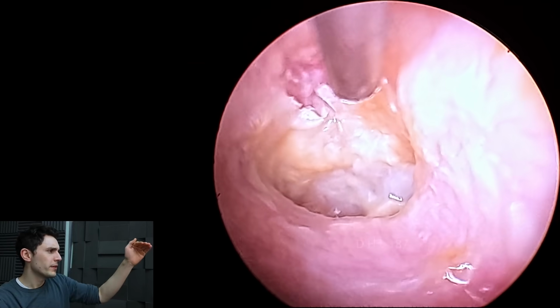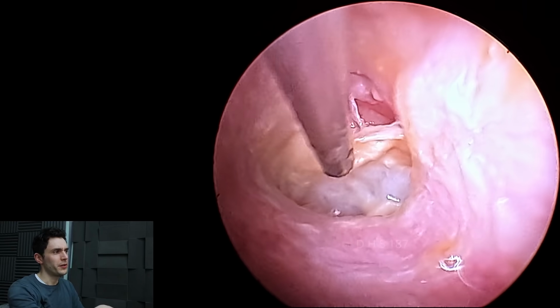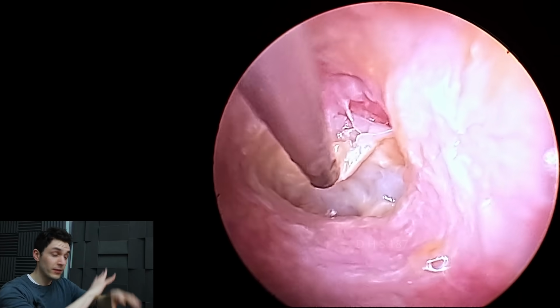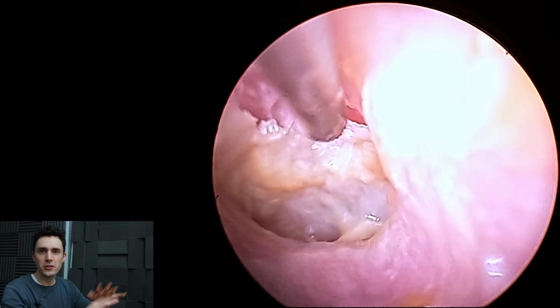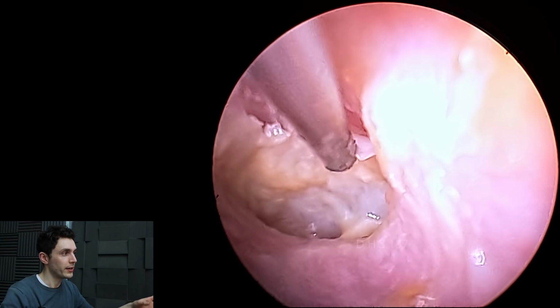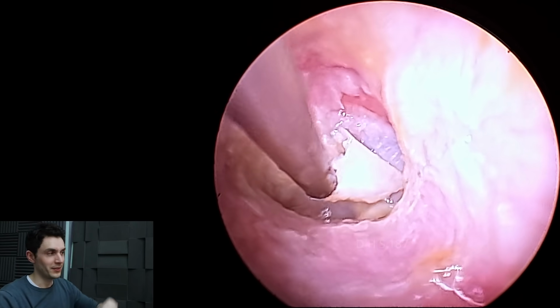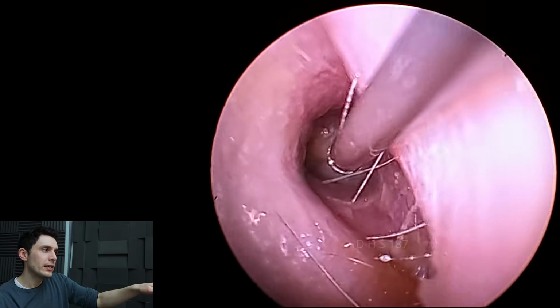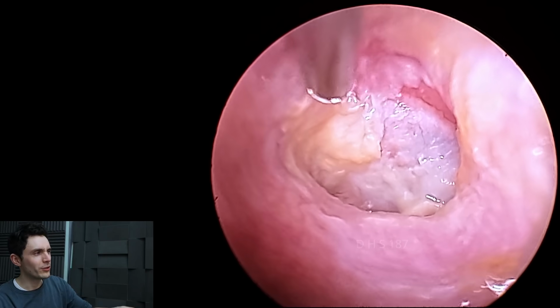So we're peeling off this neotympanum here, and actually you can see that the tissue underneath is not very happy at all. So there's clearly otitis externa, or otomycosis, I guess. Let's just go with otitis externa, inflammation of the tissues of the external auditory canal. And you can clearly see that it's red, it's wet, and it's unhappy. So you can see we do now have a more normal looking drum to an extent.